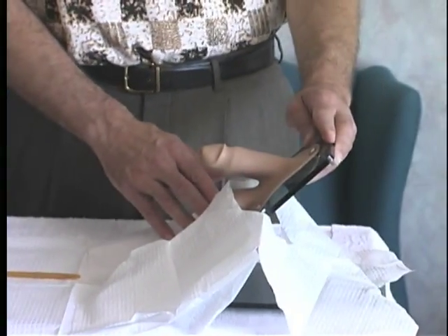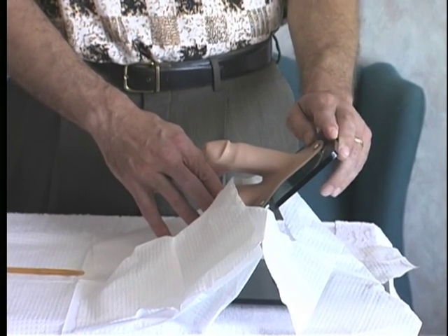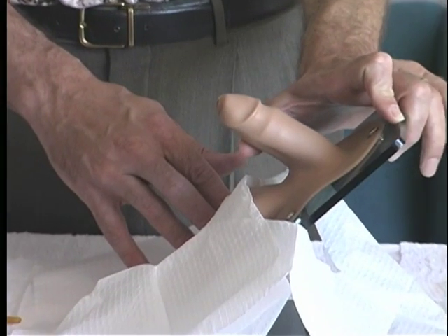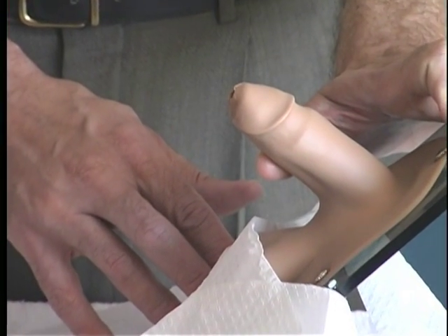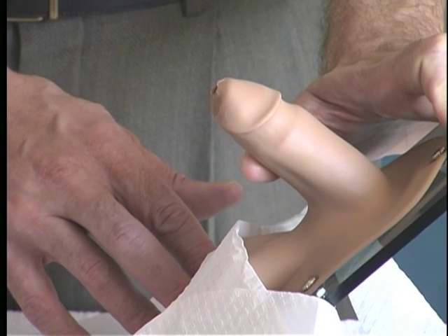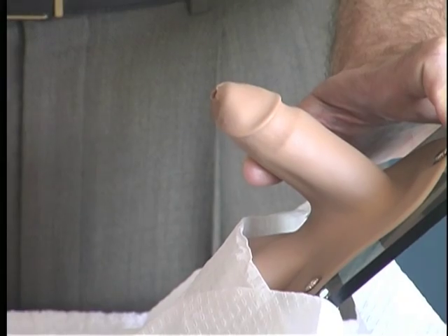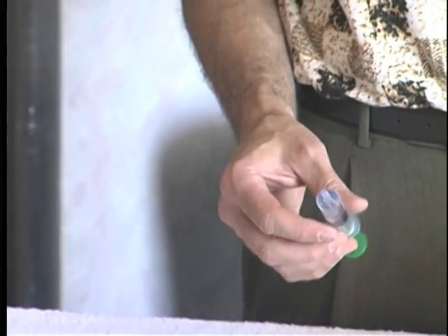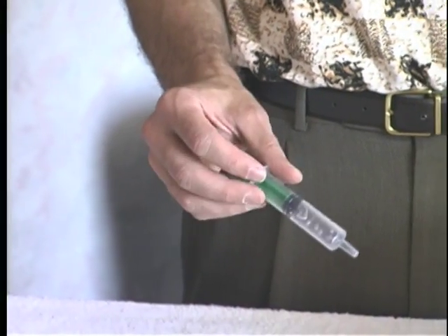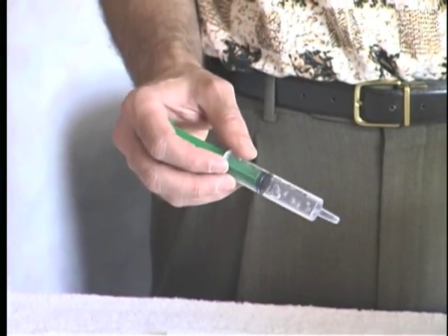In the sterile position and in patient supine, the penis should always be brought to a straight position to allow facilitated passage of any catheter through the pendulous urethra. After a sterile prep and drape, xylocaine jelly can be used or standard lubricating jelly. Currently at this hospital, lubricating jelly is supplied in a syringe.